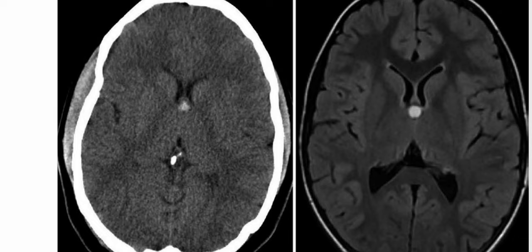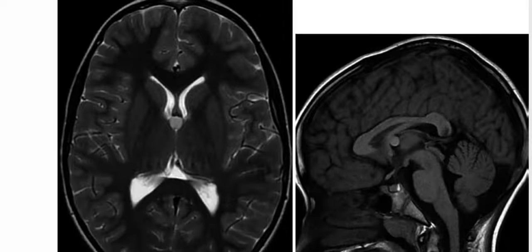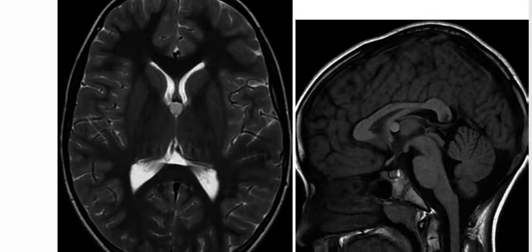This is the axial CT scan, and it shows a round hyperdense lesion along the anterior superior third ventricle, between and posterior to the fornices and the foramina of Monroe. This lesion is better depicted on MRI, and it is hyperintense on FLAIR sequence, and also on T2 weighted MRI. It is hyperintense compared to the brain parenchyma on sagittal T1 weighted MRI as well, and the columns of the fornix are seen along the superior and anterior aspect of the mass.